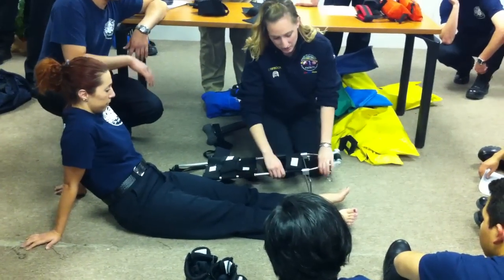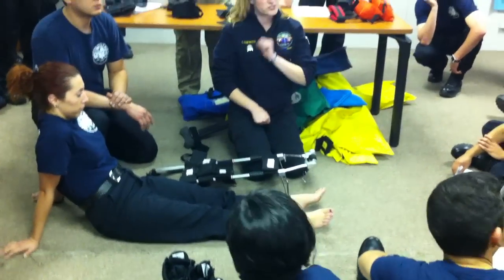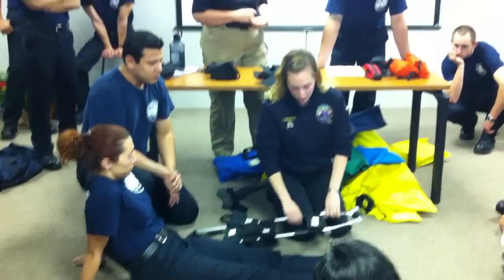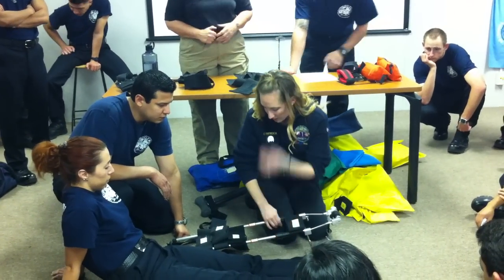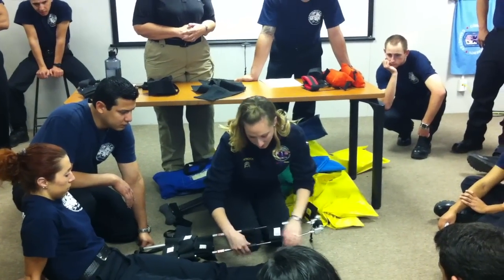And if you need to extend it, say you have a really tall person, like you're quite tall, you're going to have to pull this out a little bit so you can do adequate traction. If they're fairly short, there's only so far you can make it as small before you need to go to a pediatric. It tells you which way is locked and unlocked. I'm going to make it a little bit longer for her, because I want to make sure I can get enough traction.